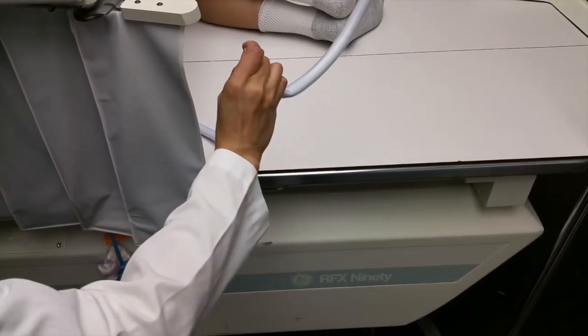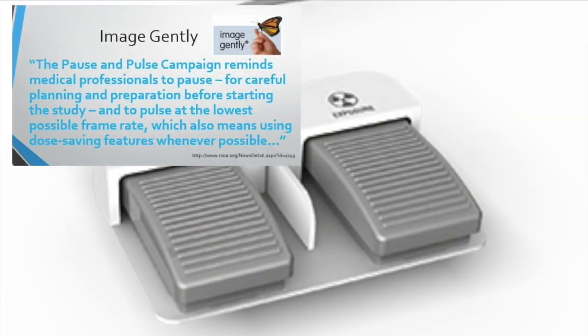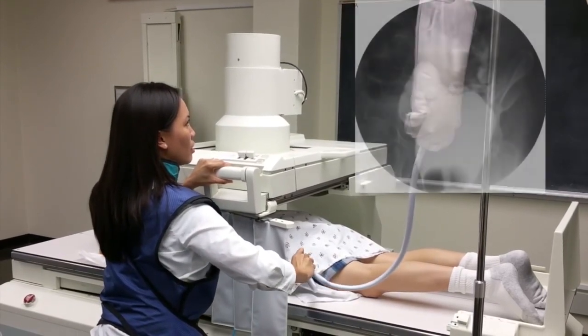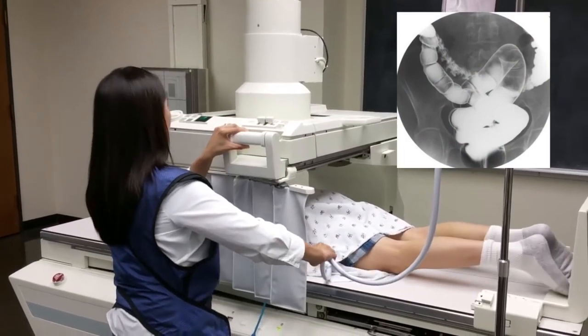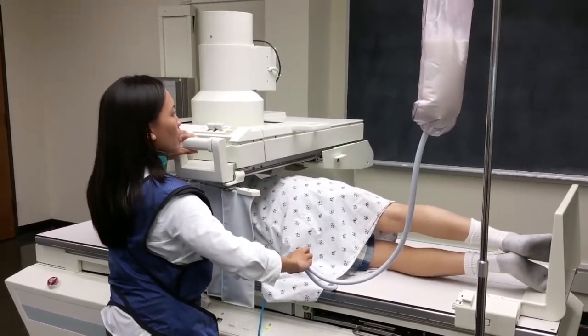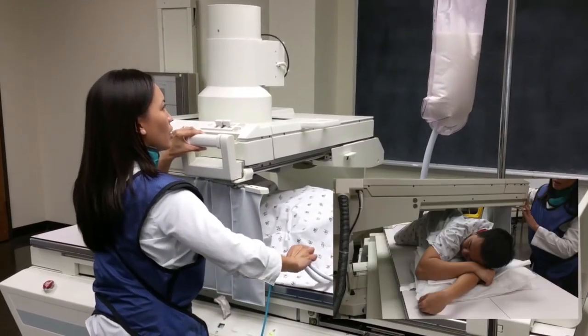My foot intermittently depresses the pedal to watch the flow of barium. In the filling phase, barium should be intermittently watched until it reaches the mid-transverse colon. In general, turning the patient to the left anterior oblique or left side down position moves barium into the proximal sigmoid colon, the descending colon, and the splenic flexure.